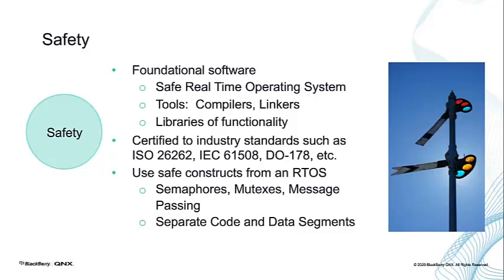So even if there's a third-party library, you want to be able to bring those in and at least assess and understand what the restrictions or requirements are from the safety use case. And then you look towards the certification standards that the system software has gone through. And I've mentioned some here. There's also the IEC 62304 for medical. So making sure that you've got software that's gone through that is going to give you a good safety basis. And then use the safety constructs from the OS.